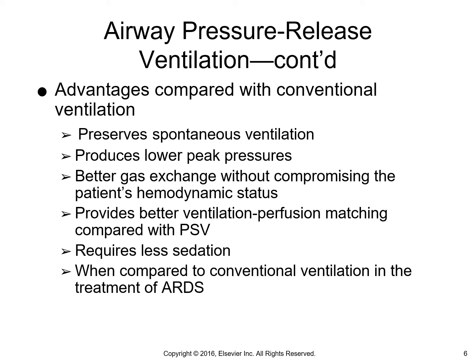So when we're looking at some of the different advantages, again, it preserves spontaneous ventilation. It does this because the active expiratory valve floats open, which also helps have lower pressures than during spontaneous breathing, preventing pressure buildups.